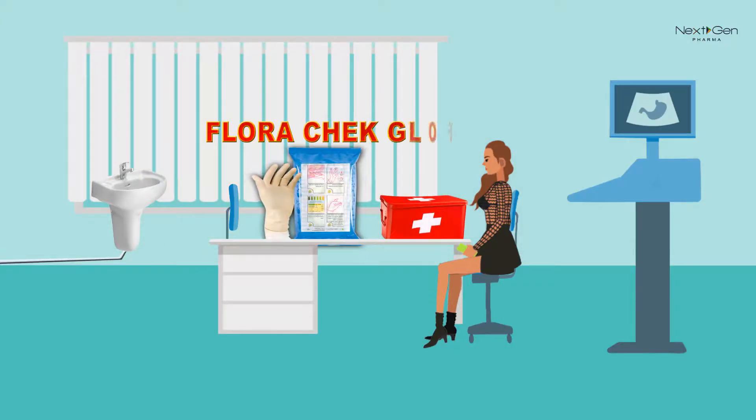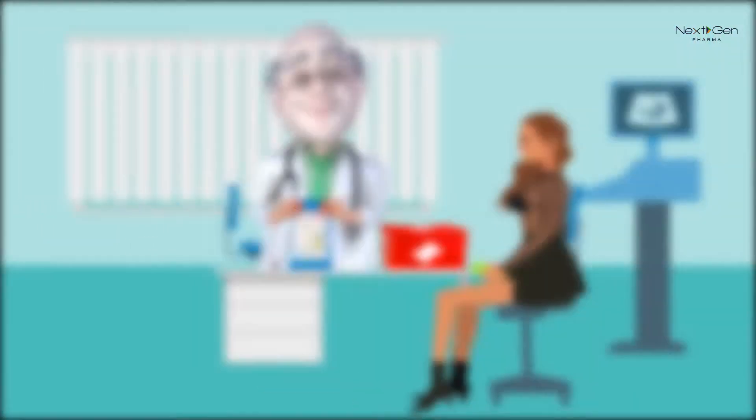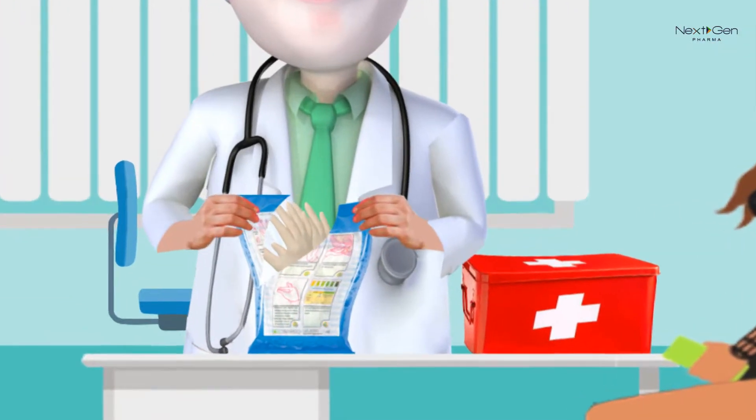Use Flora Check. Wash and dry your hands. Open the pouch from the middle by pulling apart.